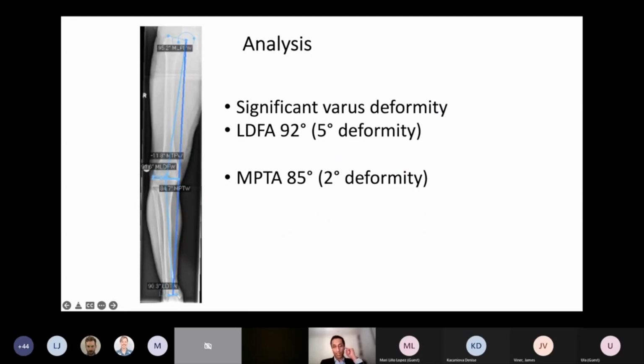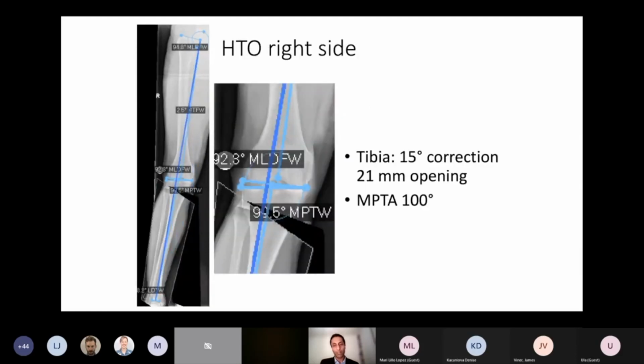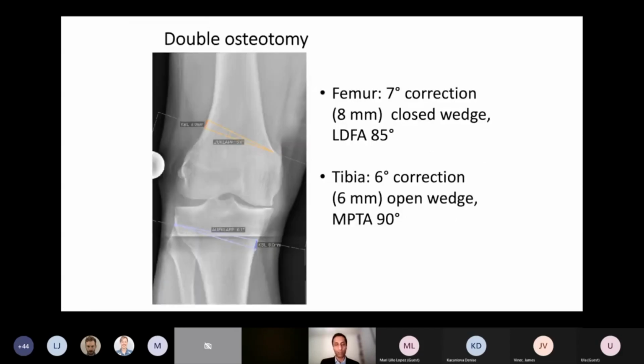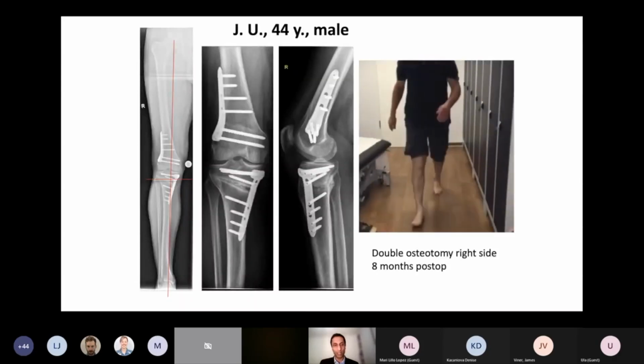This is just some of the deformity analysis that we do. And please don't worry about the figures. I just want you to understand that actually the deformity was arising from both the tibia and the femur. And if we just simply did a deformity correction on the tibia, you create a really abnormal joint line. And so you need to do it both in the femur and the tibia to create normal biomechanics in the knee joint. And these are just the figures that we planned based on our osteotomy planning.